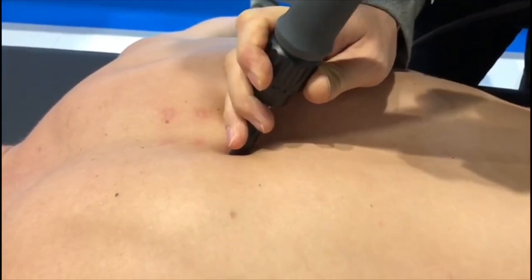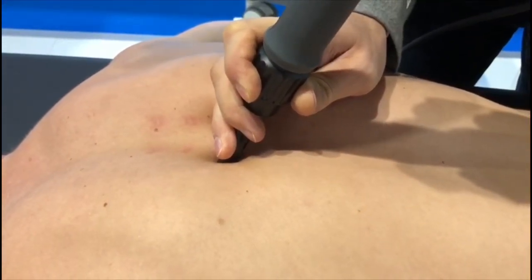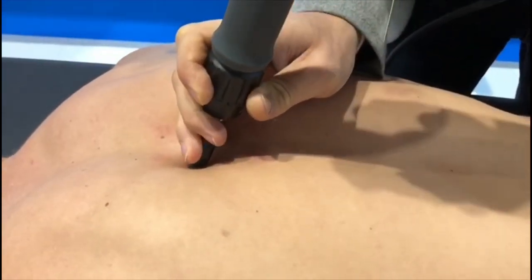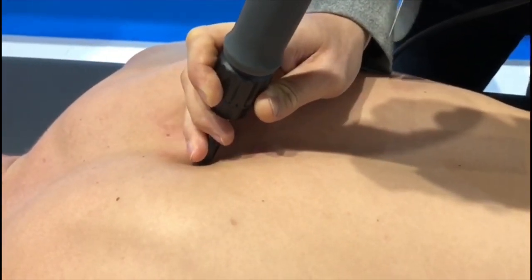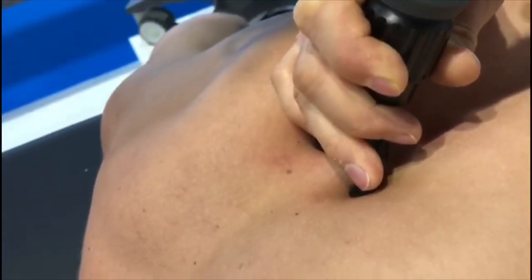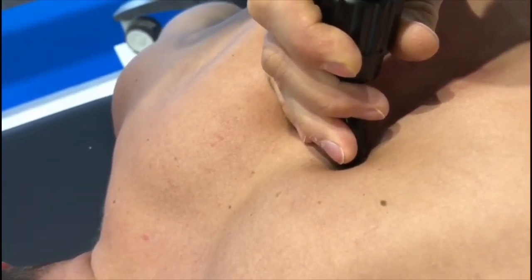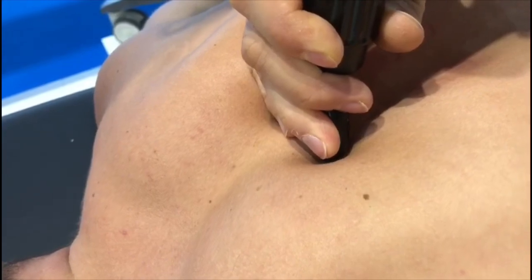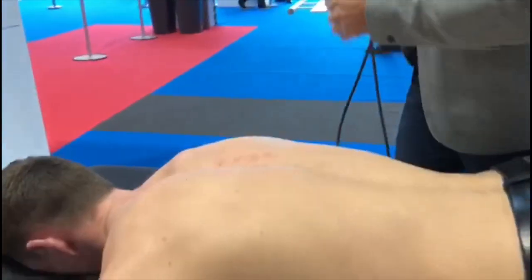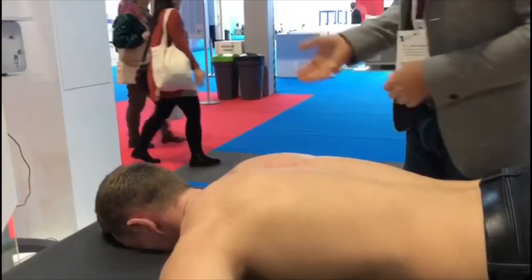This is more in a neutral position of the joint, so we're trying to see if I can reach a little bit deeper down when the muscles are relaxed. Still have a little bit of twitch here. Okay. See if we have any difference in outcome. Then you can sit up again.